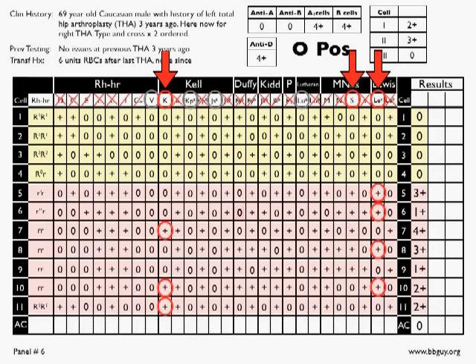Let's try the combination of anti-big K and anti-Lewis A. Well, you can see right from the beginning with cell 5 and cell 6 that that's not going to work, because the only things present in 5 and 6 are a double dose of Lewis A, and you've got a 3+ versus a 1+, and that really doesn't make a lot of sense. So cruising down to cell 7, which has a big K and has a 4+, maybe. Again, you've got another 3+ with only Lewis A in 8. That doesn't make sense. You've got neither in cell 9 with a 1+ reaction. That doesn't make sense. And again, 10 and 11 just don't work, because they should be stronger in 10 if they are truly both there. So that combination doesn't work well.